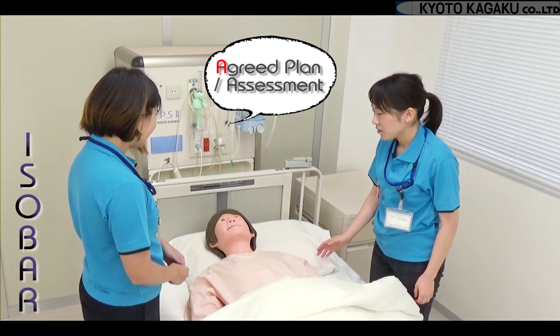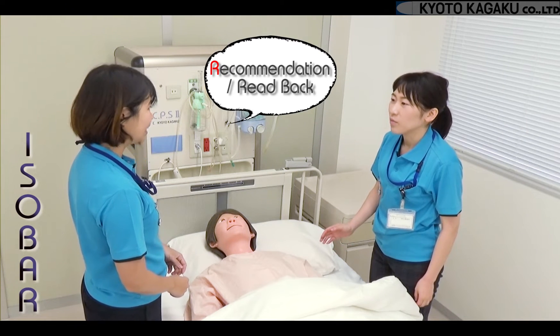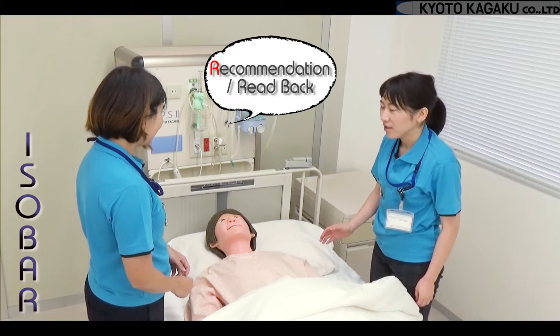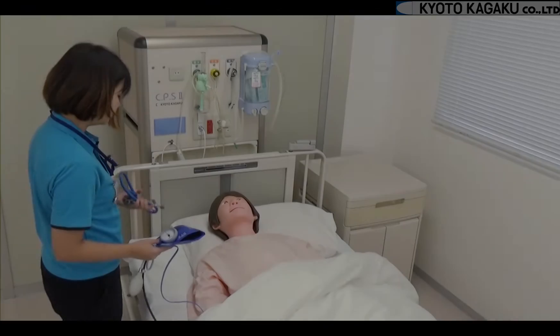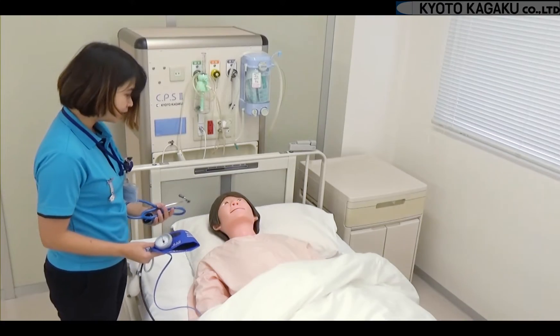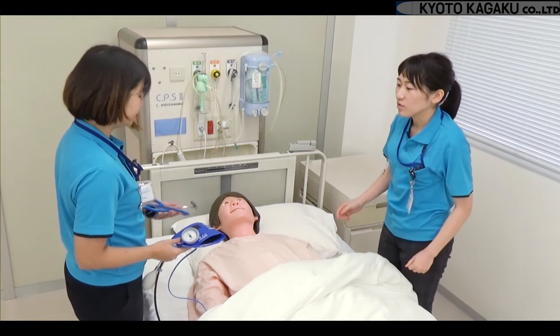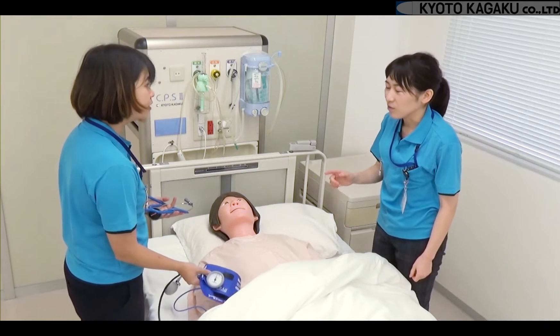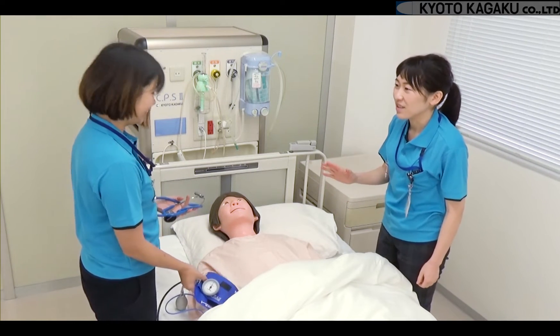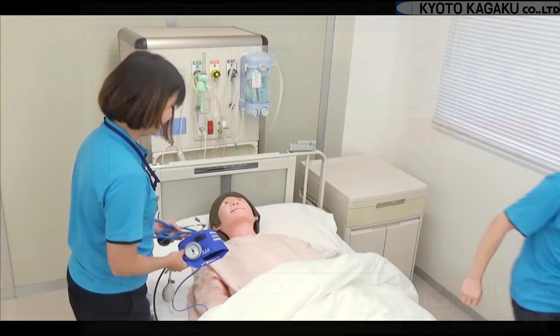I will take another set of vitals. Can you please help me with an ECG? Remember to reassure the patient by staying with them and maintaining communication — this is also important in terms of patient safety. I will let the doctor know as well.